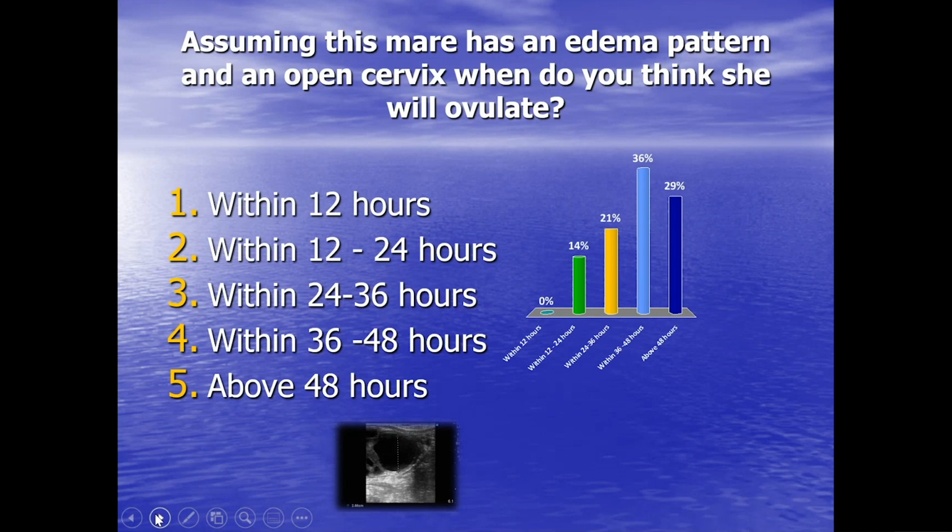Now, if we look at what people asked when I last polled the question, the majority figured within 36 to 48 hours. A significant percentage above 48 hours, and a good percentage within 24 to 36 hours, and some even within 12 to 24 hours.